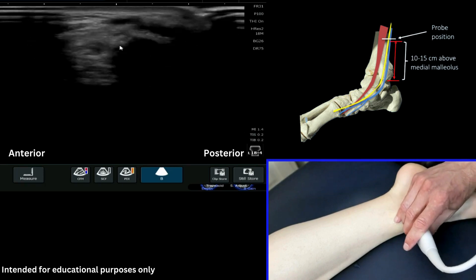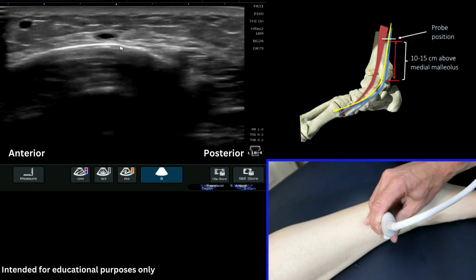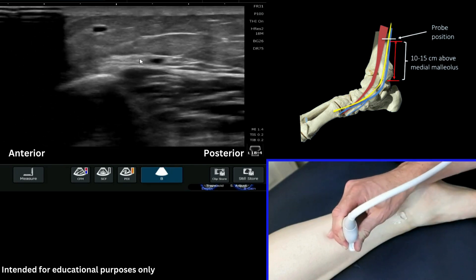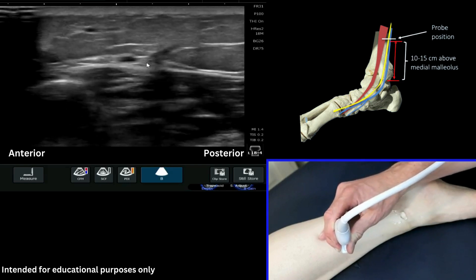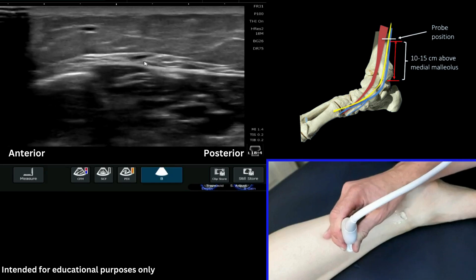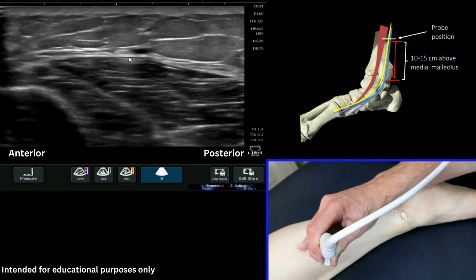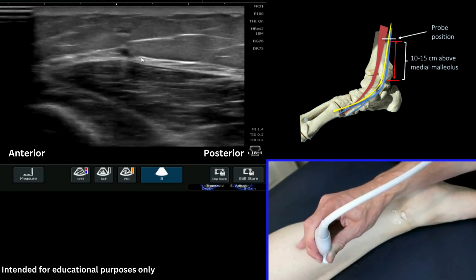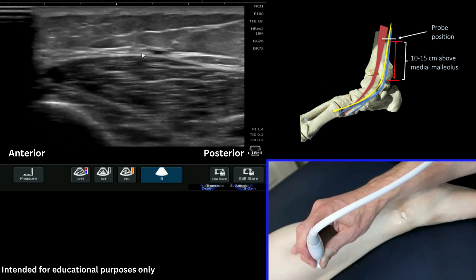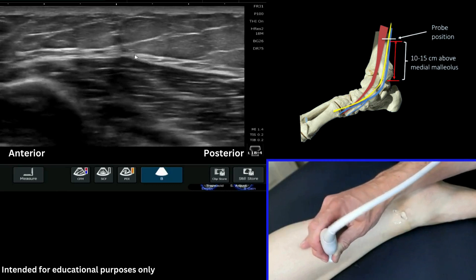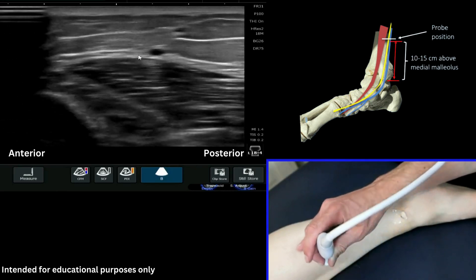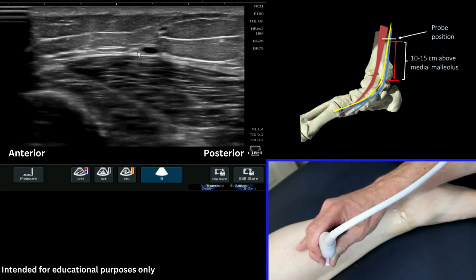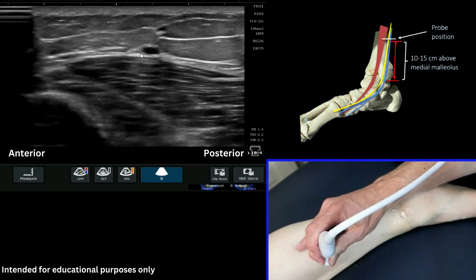Then what happens is that it transitions across and drops down onto the dorsum of the foot. The saphenous nerve does bifurcate about 10 to 15 centimetres proximal to the medial malleolus, and as you can see there are various branches of the saphenous vein that pop off and join at various points as well. But in terms of identifying where that nerve is, this is a good starting point: mid shin, pop your probe on, find the tibia, roll back — there's your vein and there's the nerve just sitting adjacent to it, shining away there in that little pocket next to the vein.